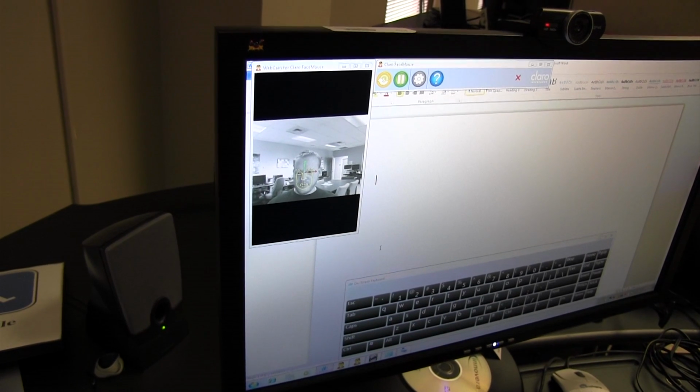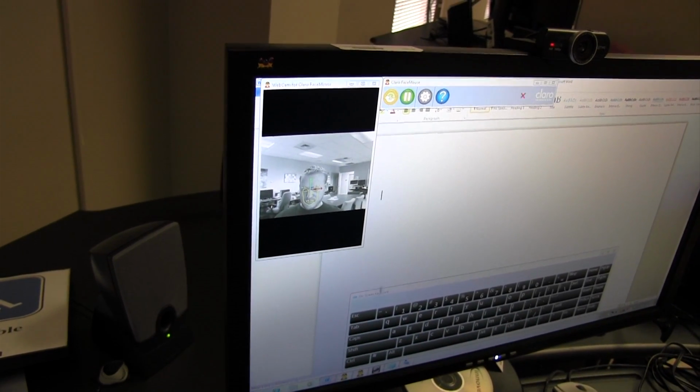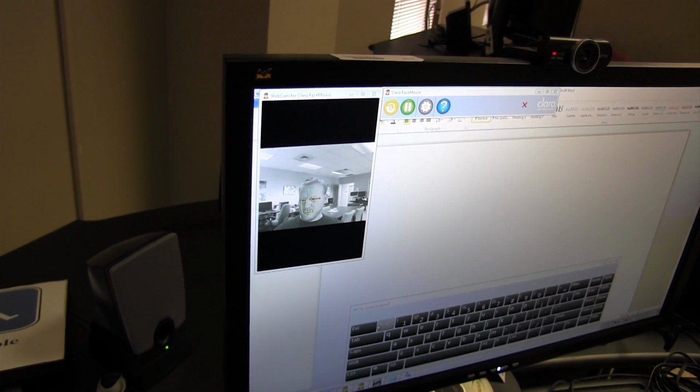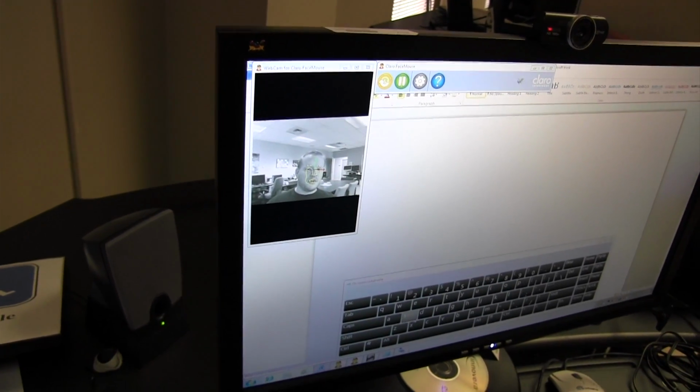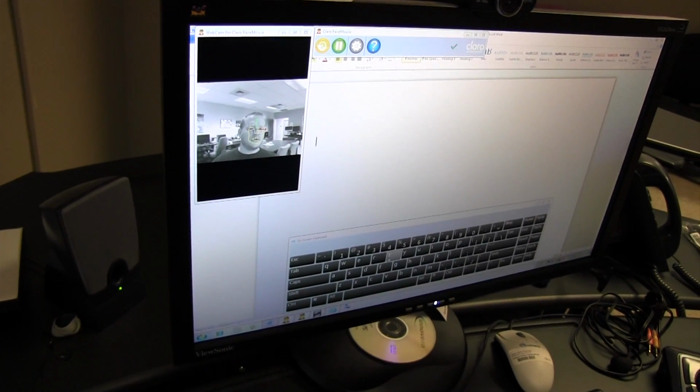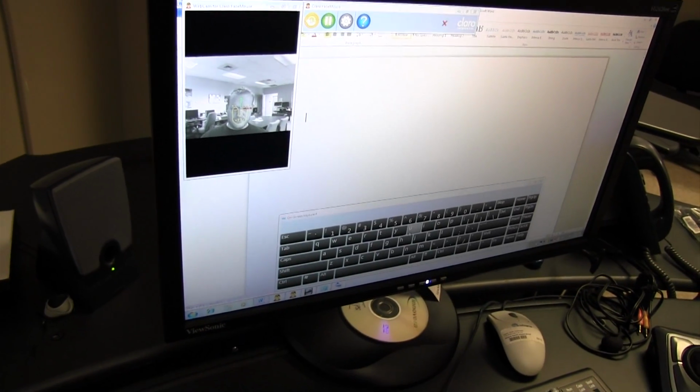And I'm going to use mouth movements. I've actually preset this to use mouth movements. You can do things like hover mouth, so if I hover over an item, it'll actually click it. But I'm going to go ahead and say hello to you.